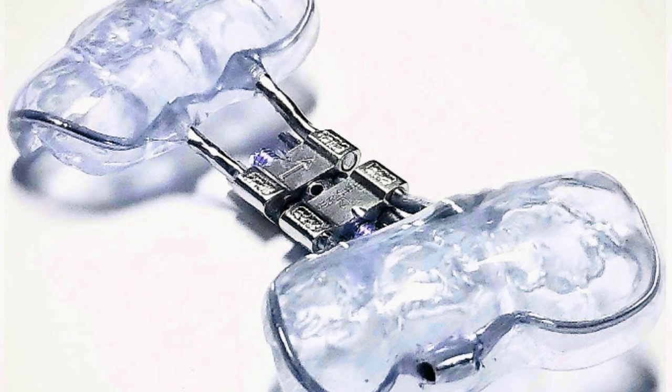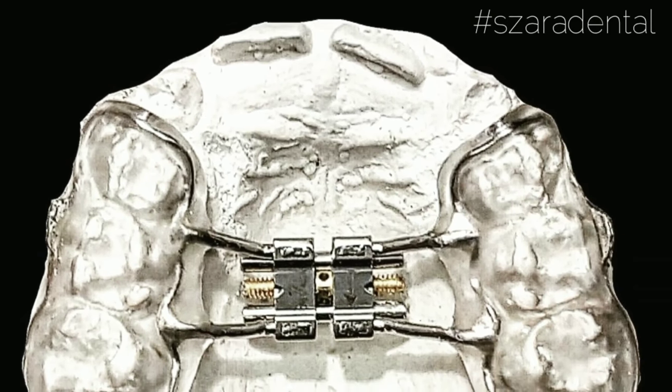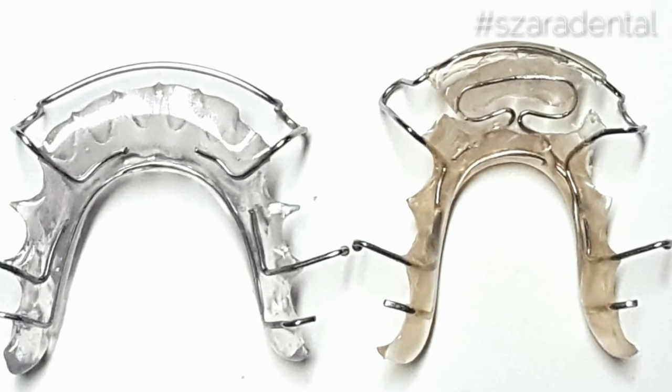Here's an example — if you use blue monomer, you'll get a blue shade. So make sure you get that mix right and you'll get perfectly clear retainers.